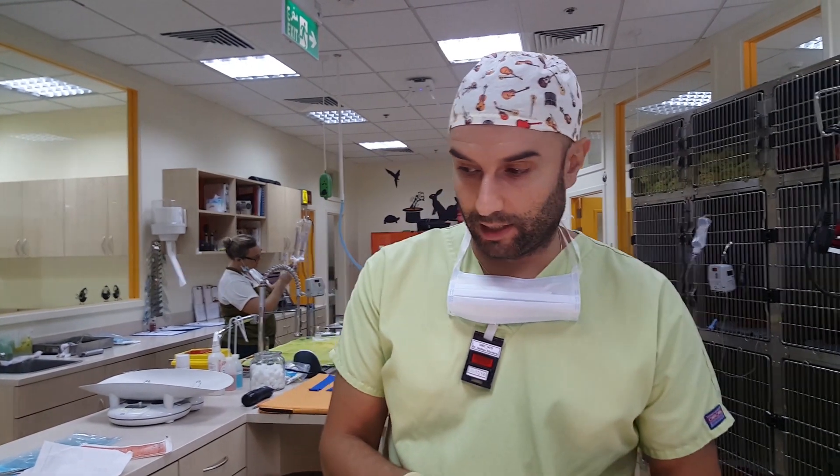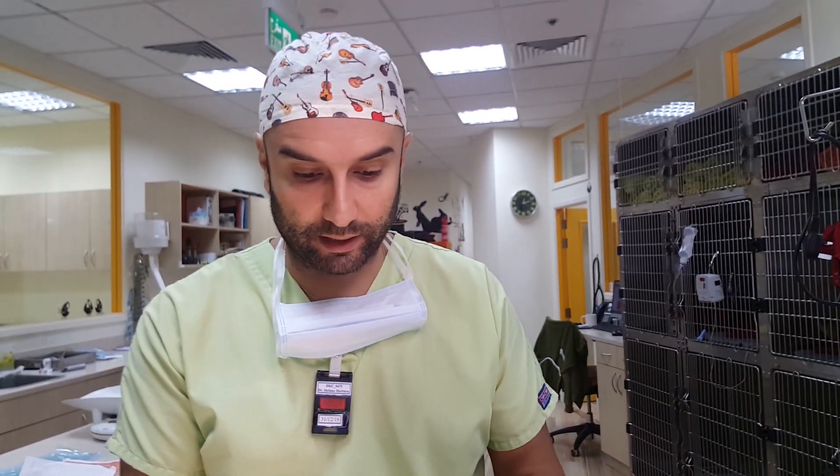We have little Cleo on the table. She was hit by a car a couple of days ago and arrived here at the clinic with several traumas, but because of the state she was in and the shock she was in, she was stabilized first. Today, under anesthetic, we've taken some x-rays.